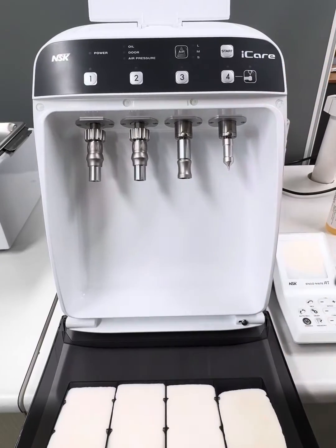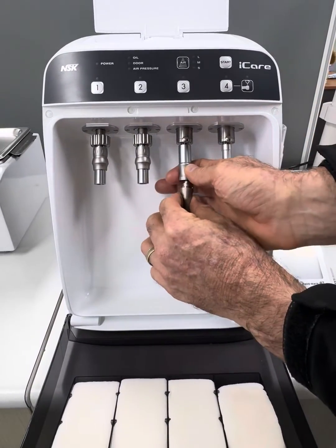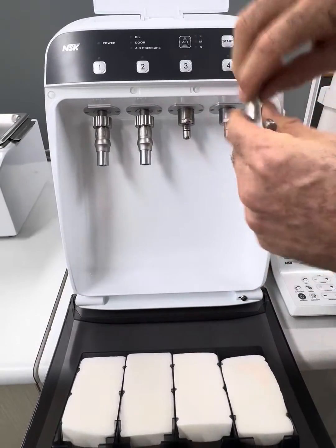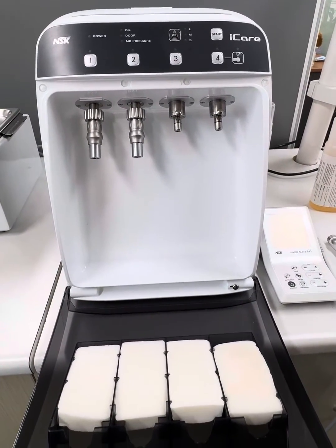Again, I won't go through that process now, but I just wanted to highlight this adapter, which I think is fantastic — very easy to take on and off. You can even store it up in the lid there with your head clean nozzle. And there we go. Thanks very much.